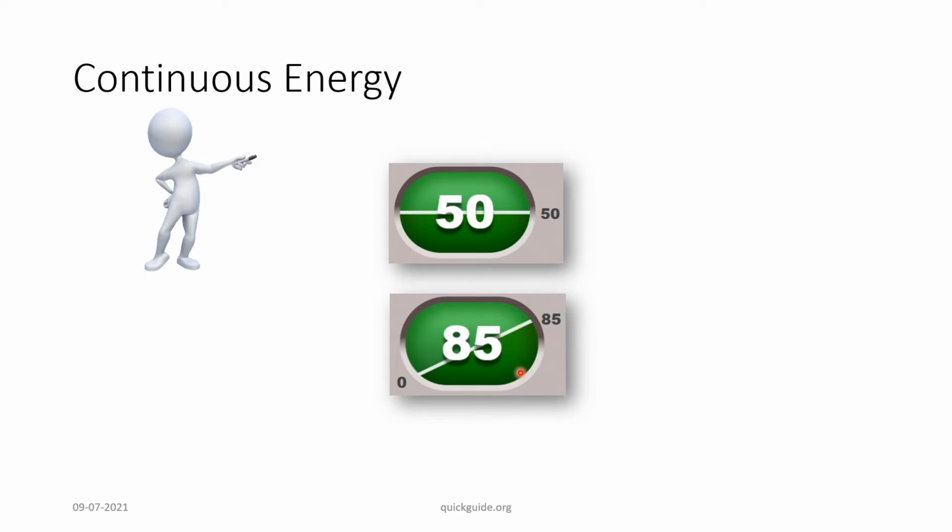In this example, you have selected a linear mode of energy delivery inside the eye. So in this, as you press foot switch position 3, at the start of foot switch position 3, you start getting 10, 15, 20%. And then as you reach the end of foot switch position 3, you get 85% of your total stroke length, because that is what you have preset in the Phaco display panel.